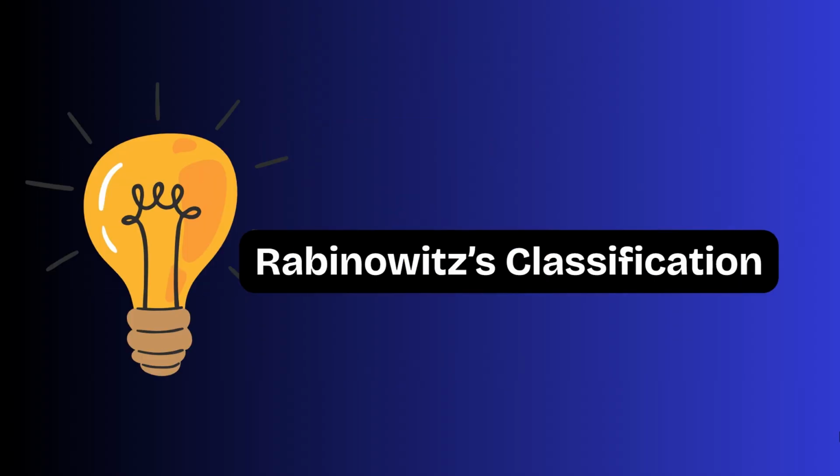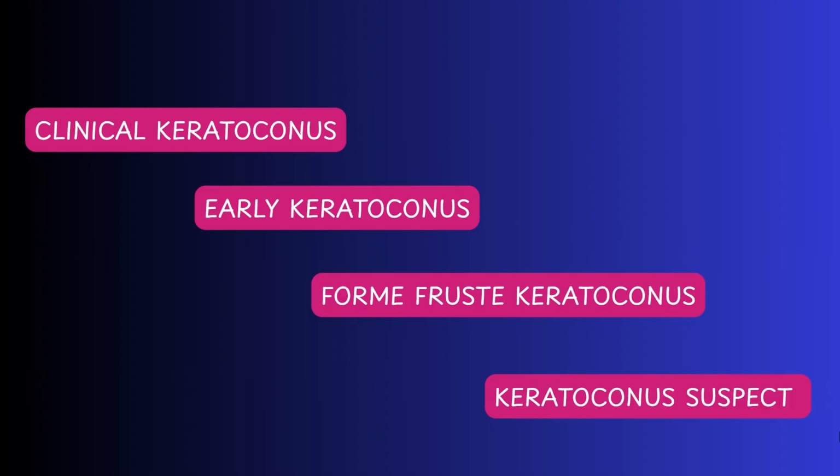Since we are talking about the anterior surface changes in keratoconus and the role of topography, it would be worthwhile to mention the Rabinowitz classification of keratoconus. Rabinowitz classified keratoconus into four main types: clinical keratoconus, early keratoconus, forme fruste keratoconus, and keratoconus suspect. Let's understand these one by one. Although this is an outdated or old classification, it's still applicable because it's commonly asked in examinations.